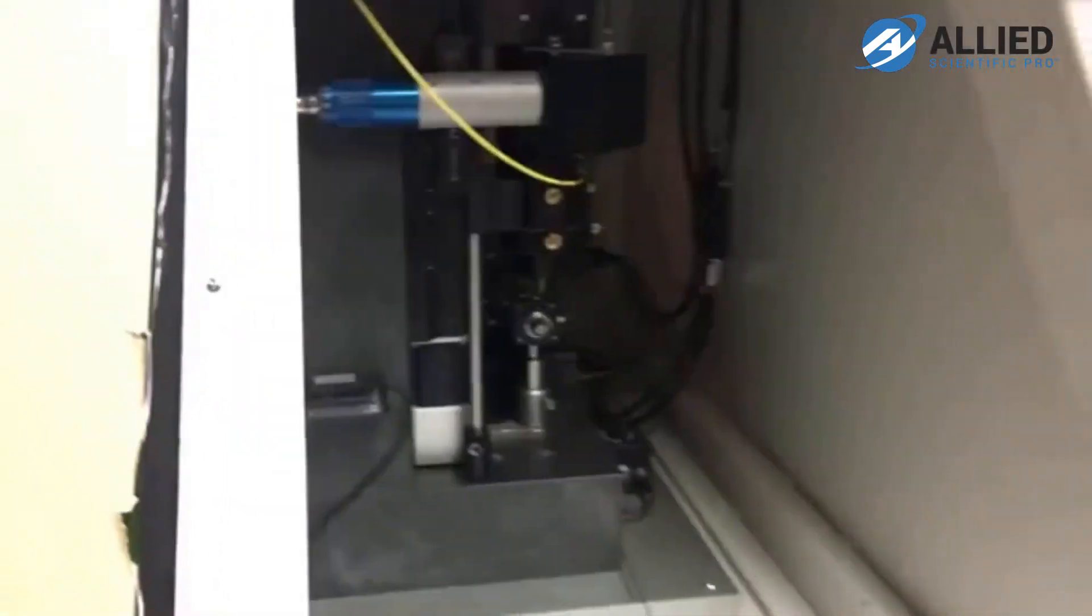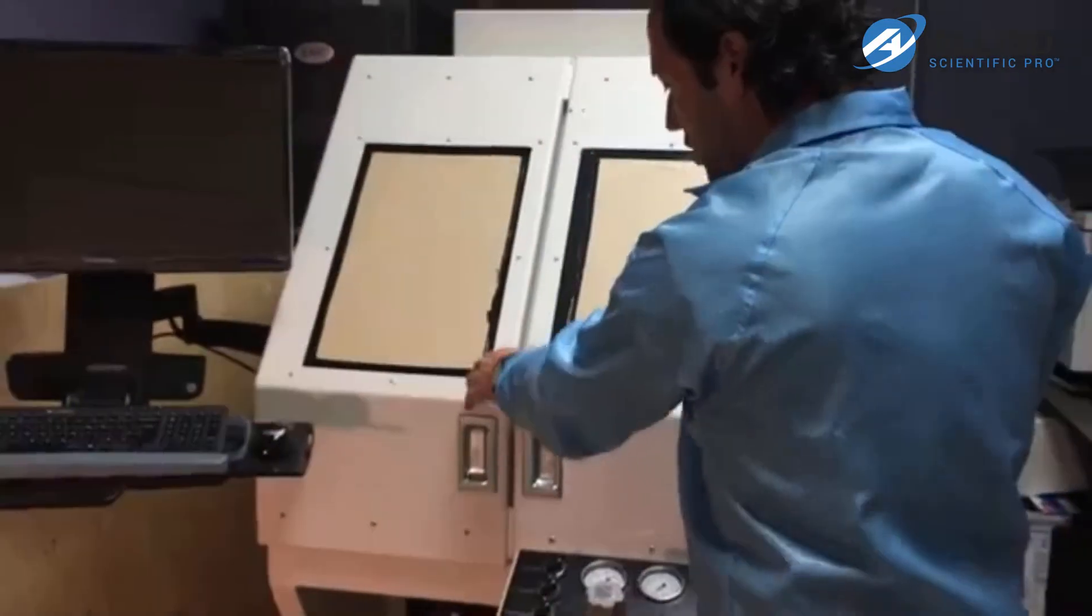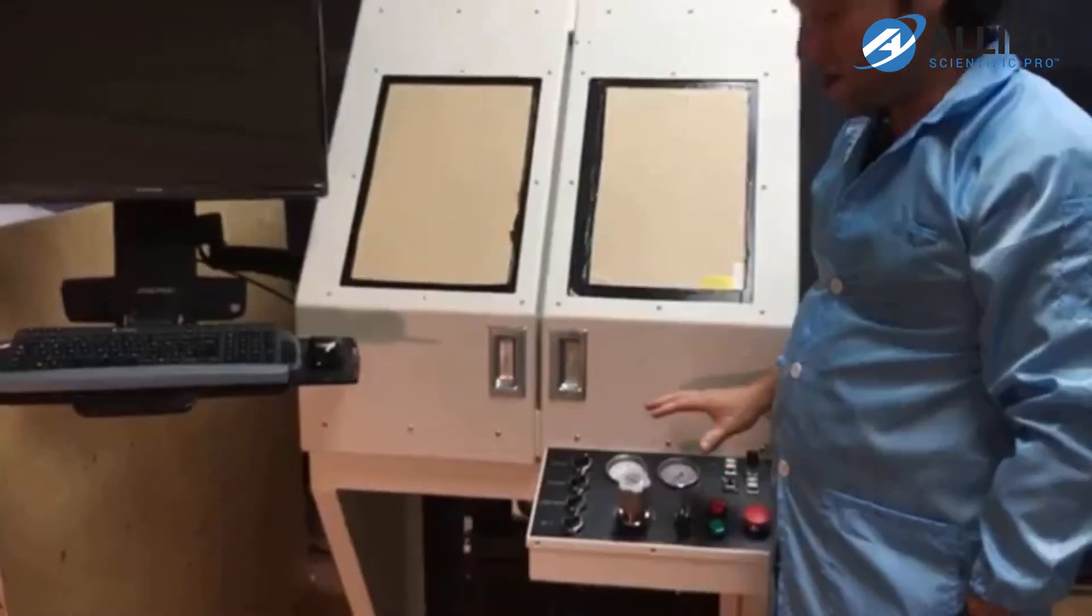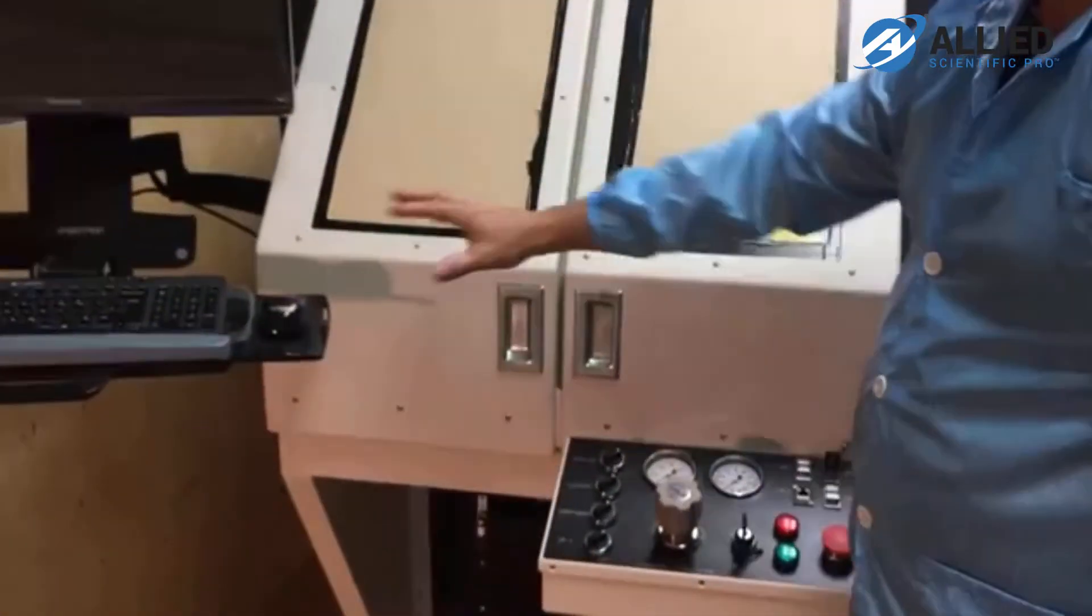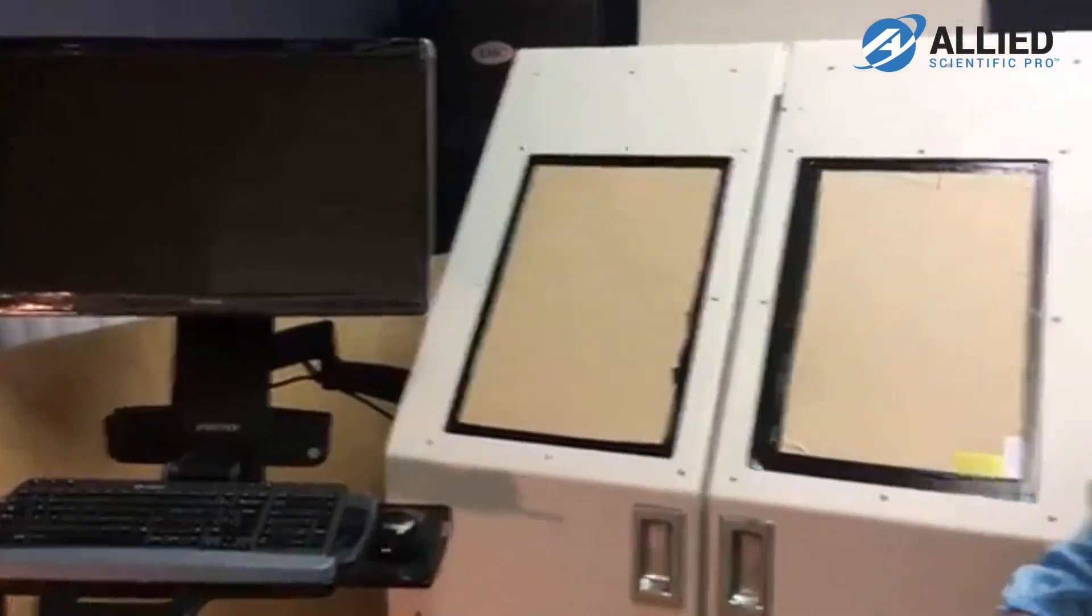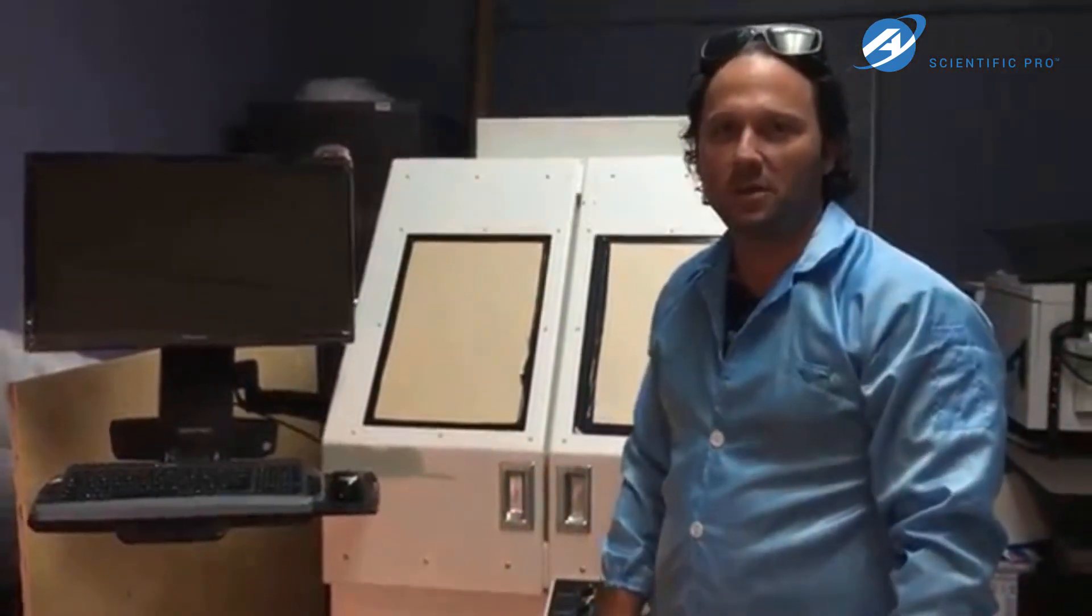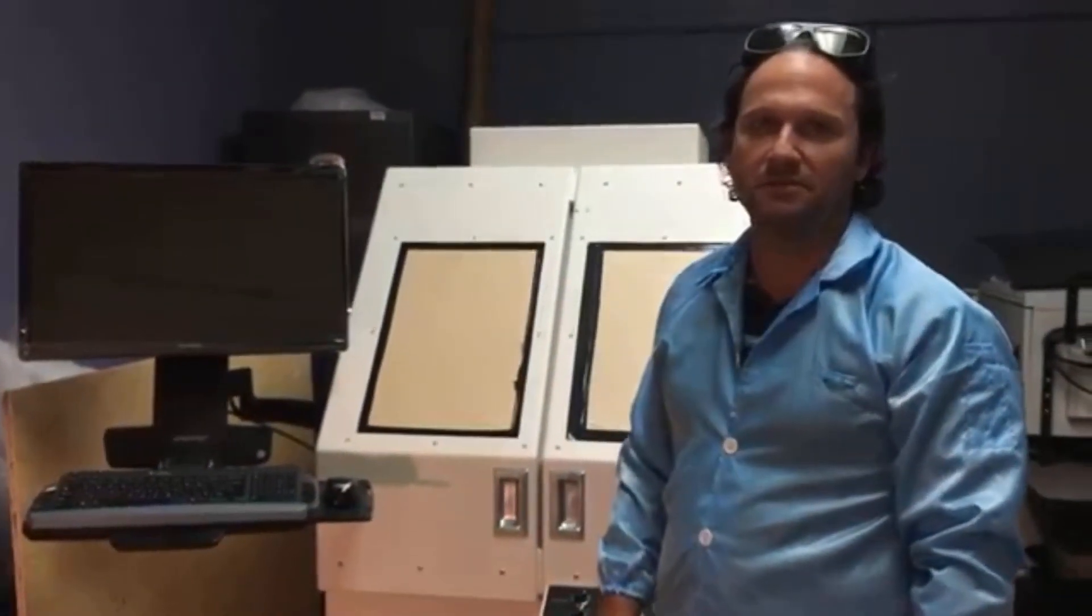You get laser safety, interlock for the door, and full control here with the computer interface outside so you can operate safely. That's a very quick summary of the stent cutting machine. Thank you.